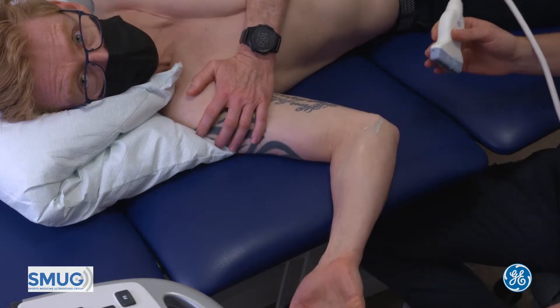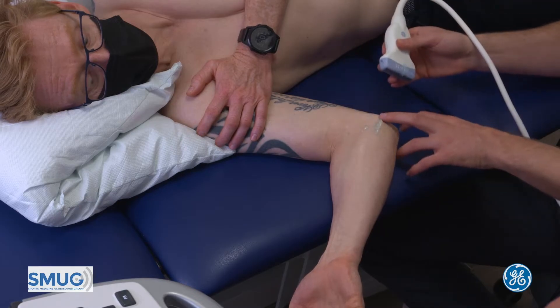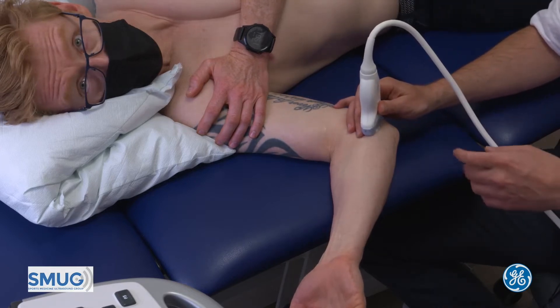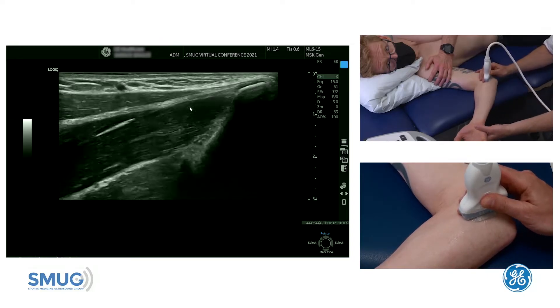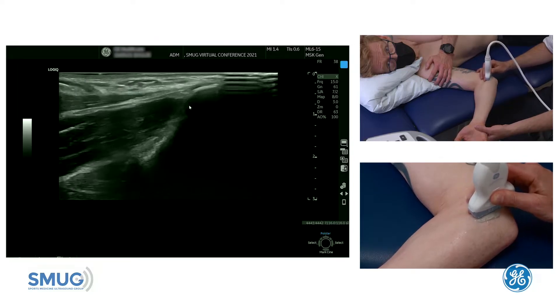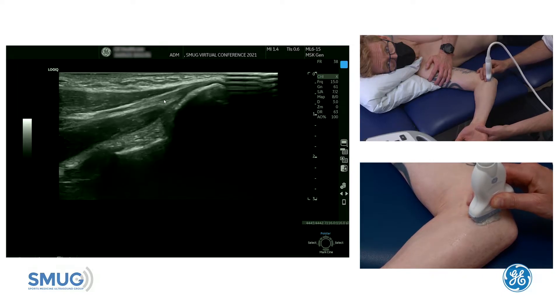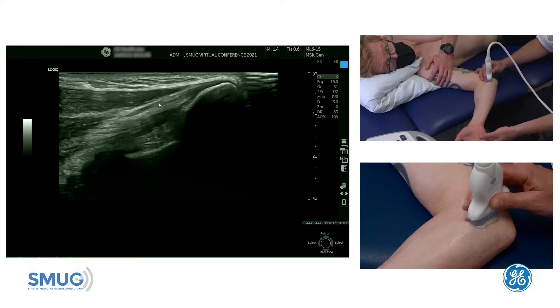It's nice to have the patient in side lying, which means we can assess what we need to and there's good access. If we pop our finger onto the medial epicondyle and place one end of the probe onto that medial epicondyle, pointing the other end up towards the thumb, then we can see the common flexor tendon attachment onto the medial epicondyle with the intramuscular tendon.